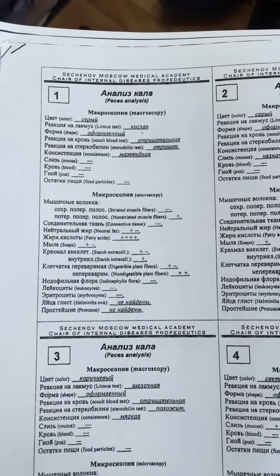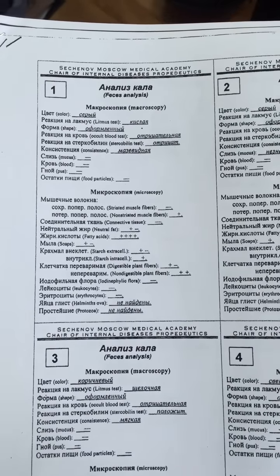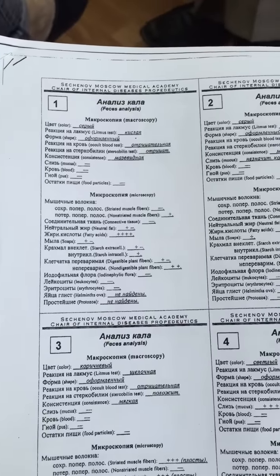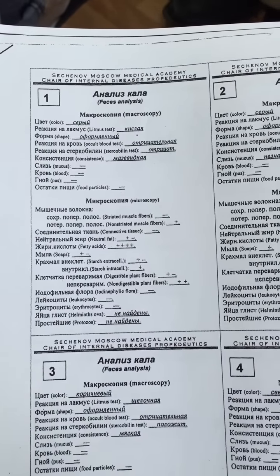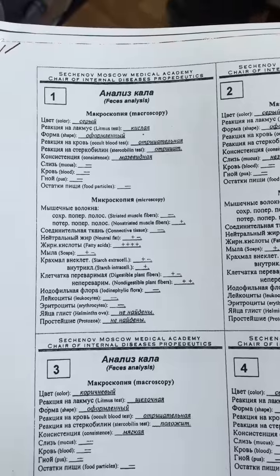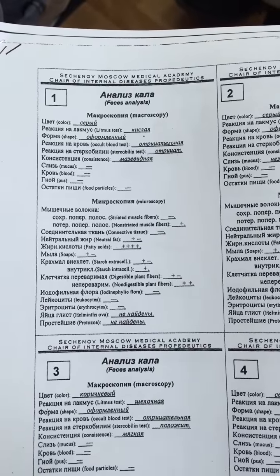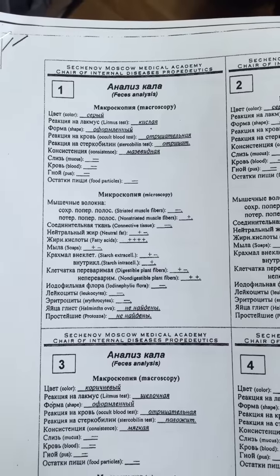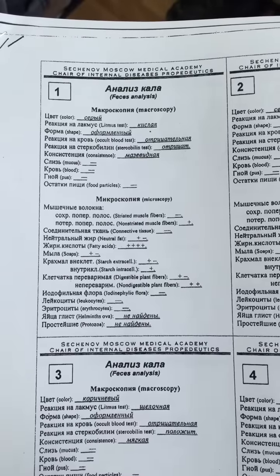Occult blood test, negative. Stercobilin test, also negative. Normally we should have stercobilin in feces, yes? Consistence. Мазевидный, it means ointment-like, yes? Мазевидный, pasty. So, mucus, да!